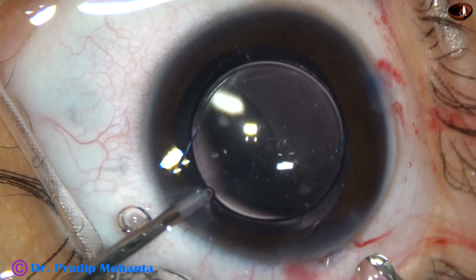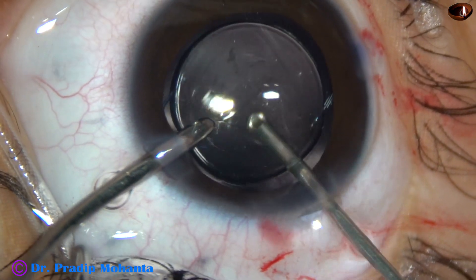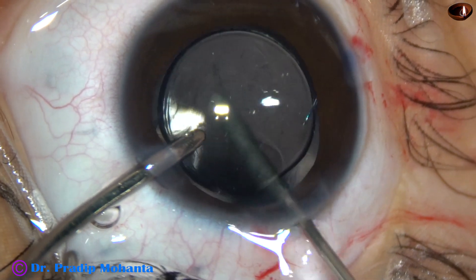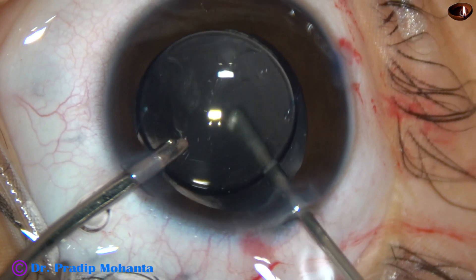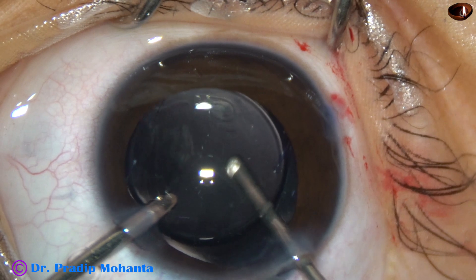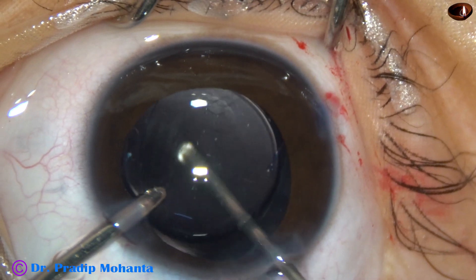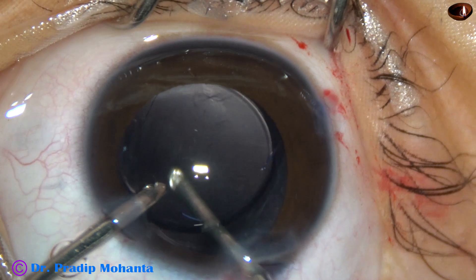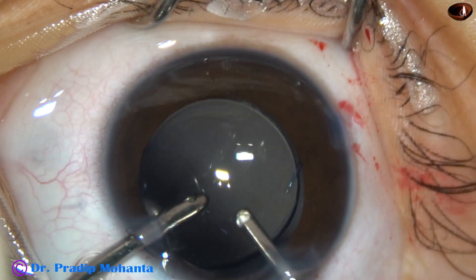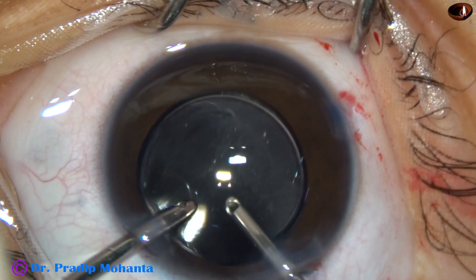Now I'm going to do limited anterior vitrectomy. Why? Because unless we remove some portion of the anterior vitreous, cells will grow rapidly over the anterior hyaloid face and form a sheet of Elschnig's pearls within a few months, and the visual axis will be obscured. So in such cases, in young children, we must do limited anterior vitrectomy. Vitrectomy is done with a 23 gauge cutter.